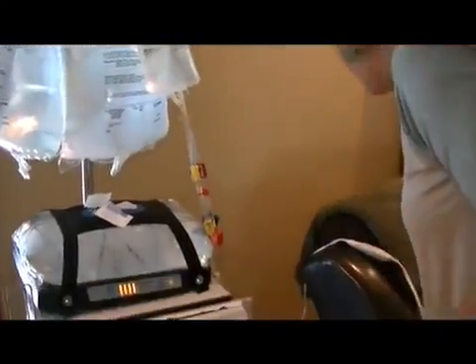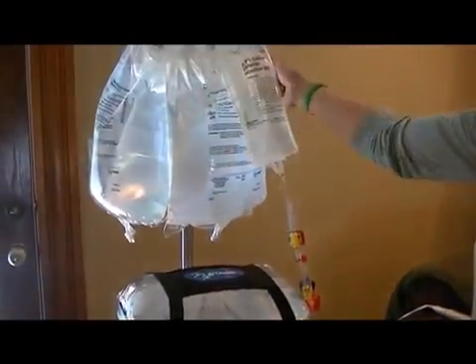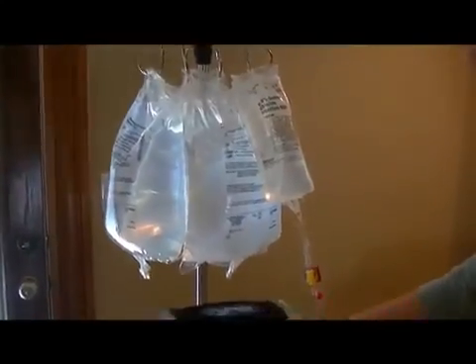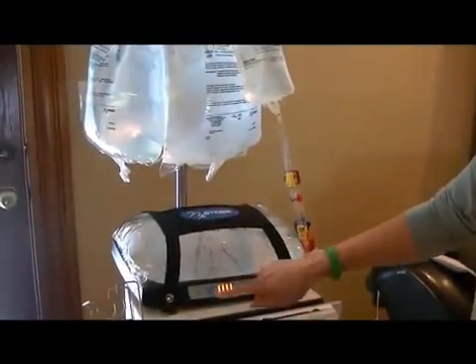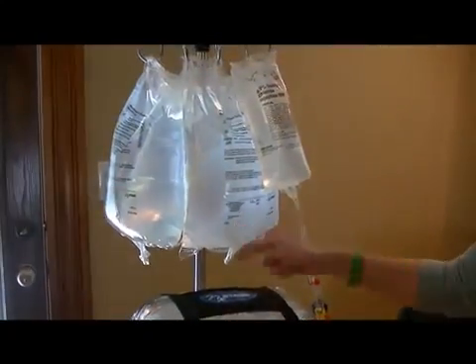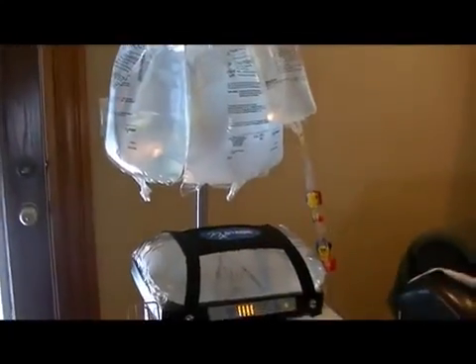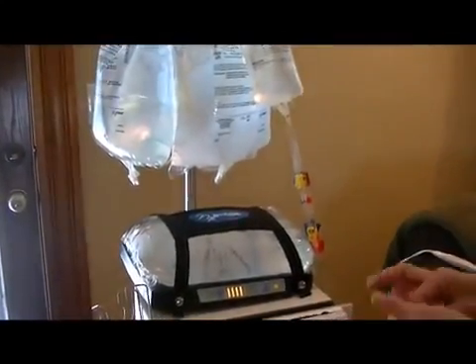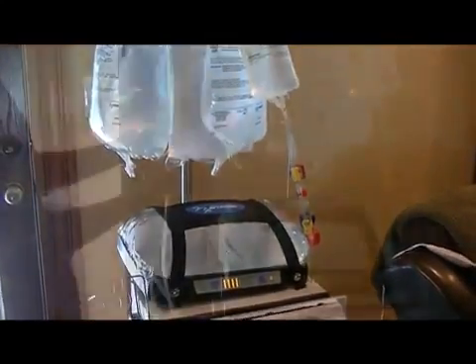Okay, so we've got those ready. And the bags of dialysate is the big bags that we have laying here, up here. This one lays on the heater. And these are orange, and when it gets warm to the right temperature, these turn green. And when I get it all hooked up, it'll continually be going into this bag so that it's warming all the time before it goes into him. He gets pretty cold while he's on it too, so that's good.